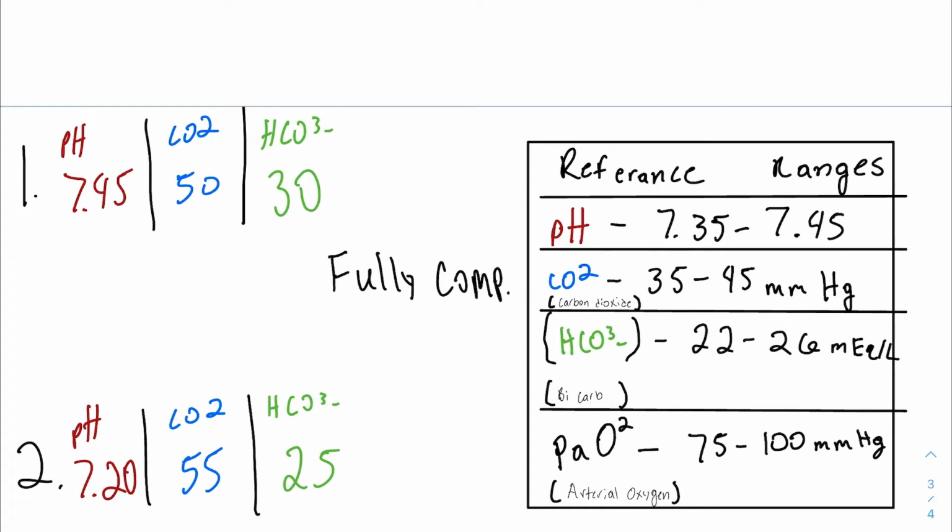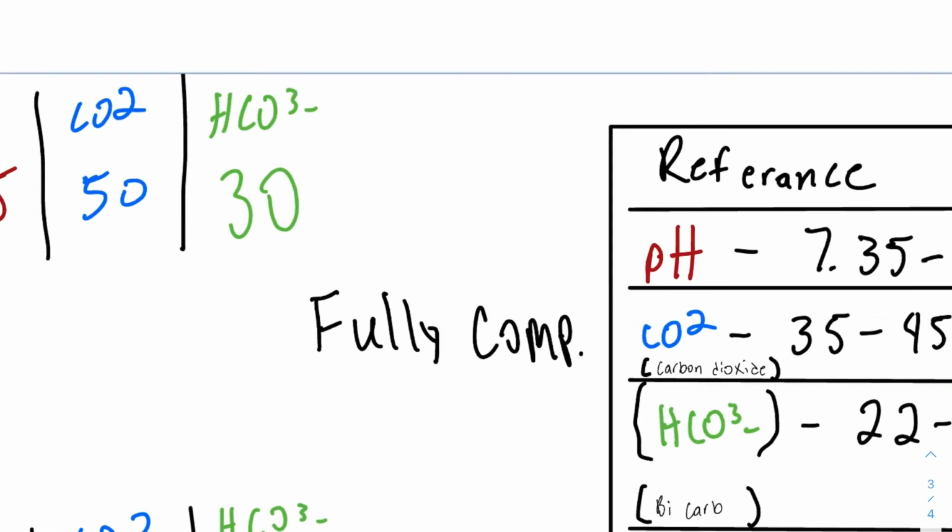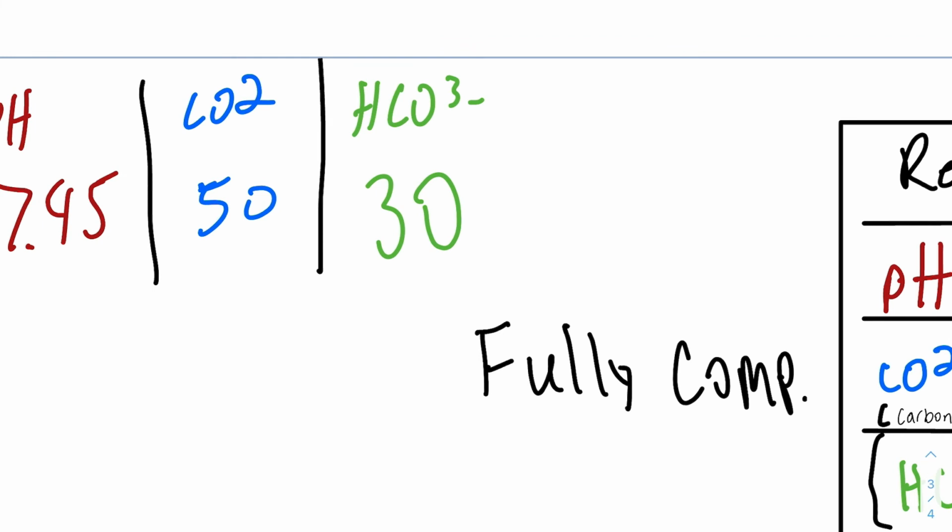Now, in real life, in clinical practice, there might not always be a problem, right? But for the purpose of your unit exam or NCLEX, there might be a problem. So we're just going to try and figure out why this pH is, yes, within normal range, but more on the alkalotic side. So let's try and find a blood gas reading that would tell us what makes things more alkalotic. You're either high bicarb or low CO2. So let's look. Our bicarb is looking a little high. So right now that is looking like our problem.